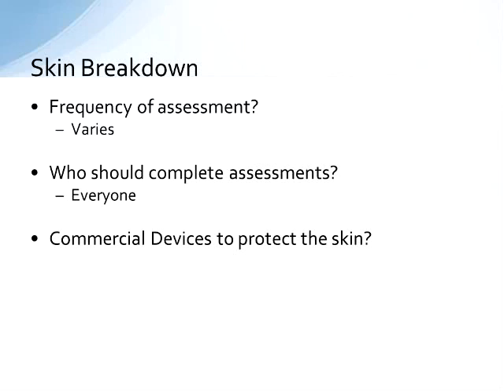And I think friction injury really comes from inappropriately sized or inappropriately placed masks in a lot of cases. But you need to be able to look at that anyway. So even if you're wearing Mepilex, you really need to be able to take the mask off and look at the skin, and really also be able to pull up and look at the skin underneath the Mepilex. So some places, if they meet those risk factors from a couple of slides ago, will go ahead and put a skin protectant of some sort on the skin. Other places will not do that until the skin starts to show issues, potential beginning of breakdown, and there really is no literature to say which way is better.